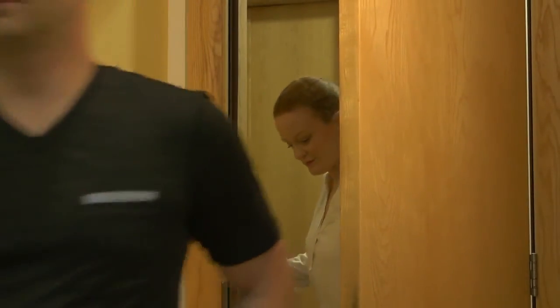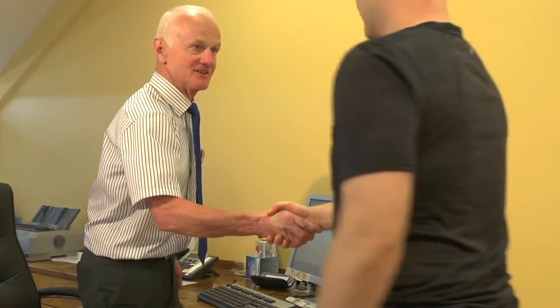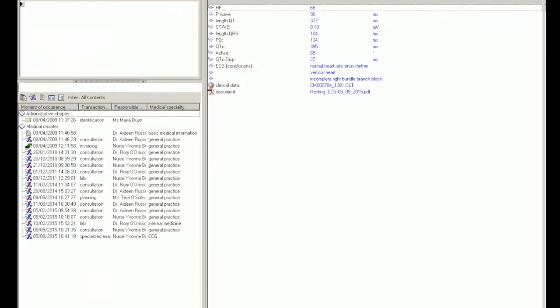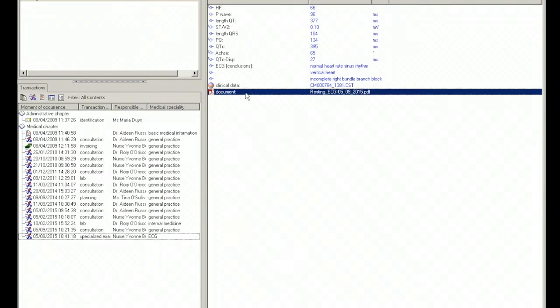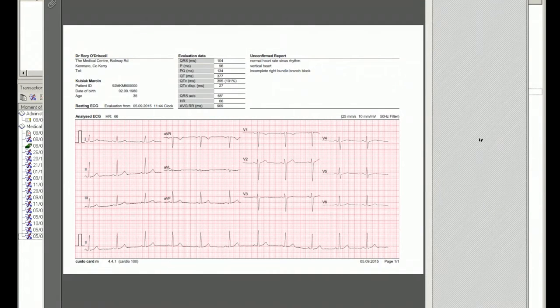The nurse notifies the doctor that Martin's test is ready and sends him in. The doctor welcomes Martin and asks how it went, then opens his file. The ECG is there and it looks normal. The doctor opens the actual tracing to have a closer look.